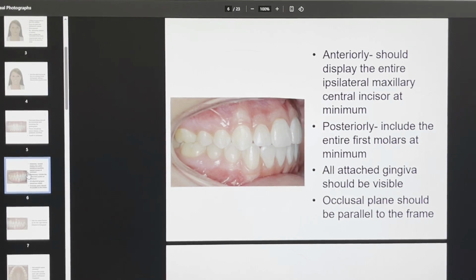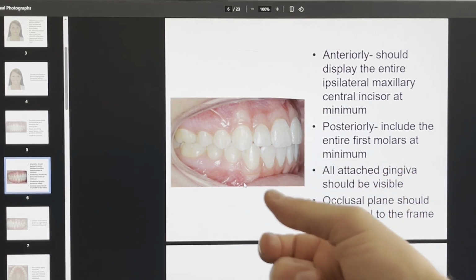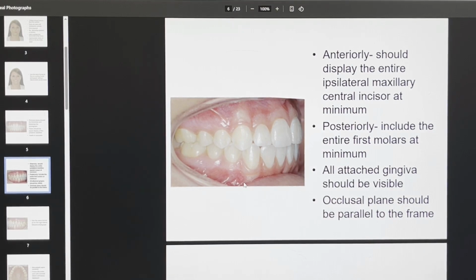It's very, very important while you're taking these shots that the person be biting down correctly. So most people who are class 2 and their lower jaw will be back, they'll want to posture their teeth forward or do some other thing. To make sure that they're biting together correctly, I'll actually gently grab a hold like this, their chin button, and I'll just kind of gently wiggle it and have them move it back gently, gently, gently until they slide back and bite into their class 2 occlusion.